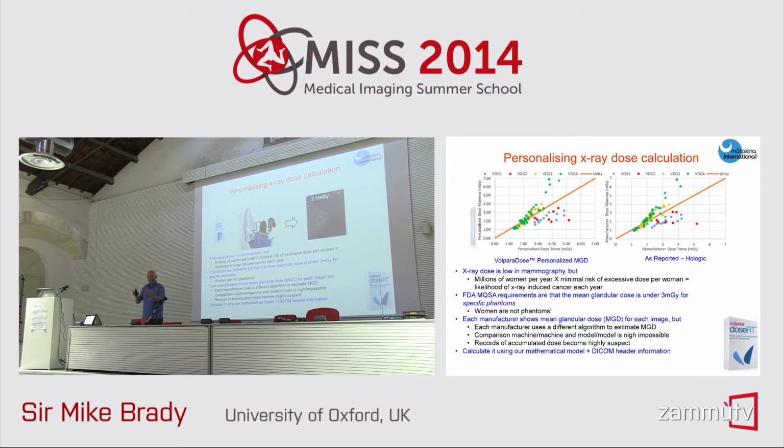Okay? So, the FDA, the Food and Drug Administration, quality control, requires that the mean glandular dose be under 3 milligray for a specific phantom. I'm not interested in phantoms, I'm interested in women. If you go in to have a mammogram, it's you that we want to understand. Right? And if you've got dense breasts, it's different from not having dense breasts. So we don't want to have a phantom measurement for this.